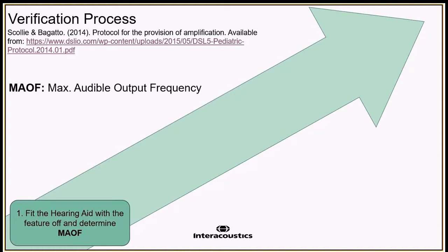And this is a very special area. It stands for maximum audible output frequency. And it's typically seen to be a target for how we can then amplify and verify this type of feature. We'll look at that and I'll explain it a little bit further on the next slide.